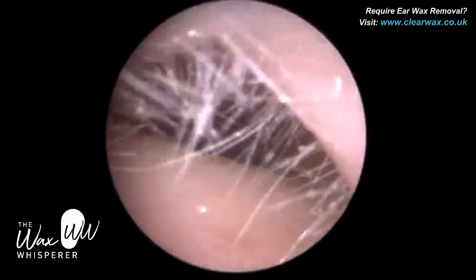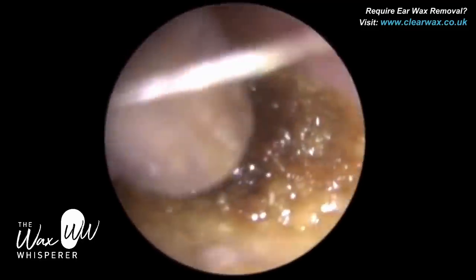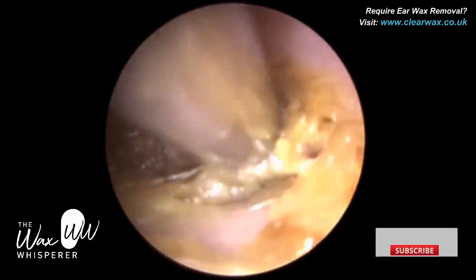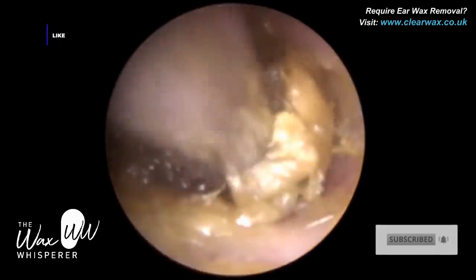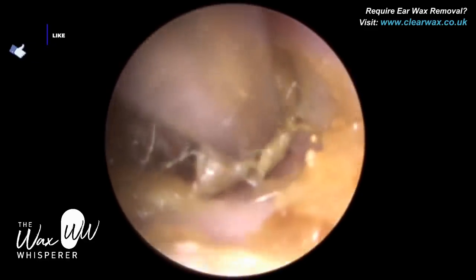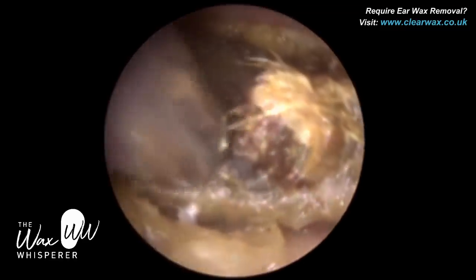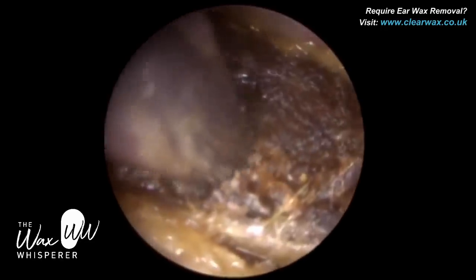The patient in this procedure attended with a fully blocked left ear with impacted earwax. They had been seen by a couple of other specialists more local to them who were unable to remove this plug of wax. The patient did return twice to one audiologist who advised them to use drops. You can see the earwax is quite wet — the lateral layer of wax is quite wet and soft — but despite that, they weren't able to remove this plug.